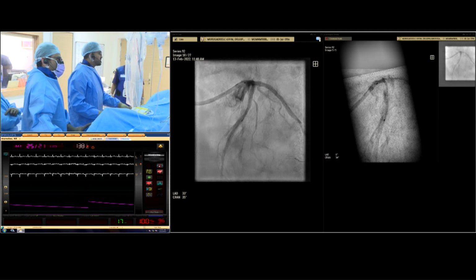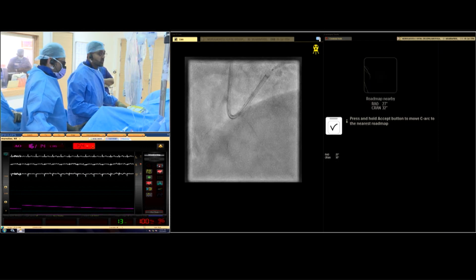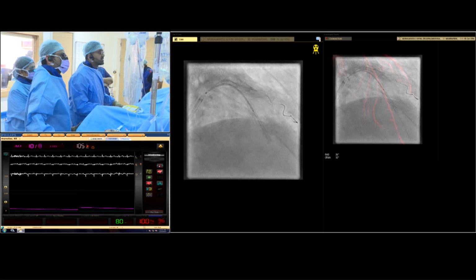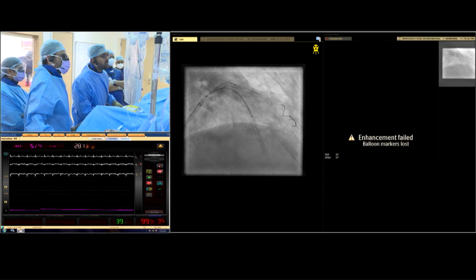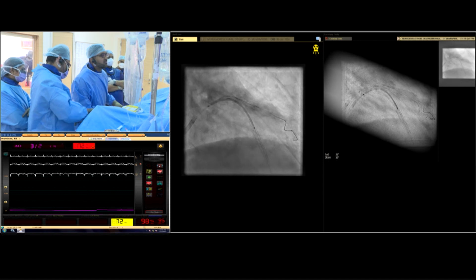Try not to talk to the patient, guys. I don't want any deep breaths. Chaps, no talking, no deep breaths. It's a bit touch and go. Abu, be prepared to go.